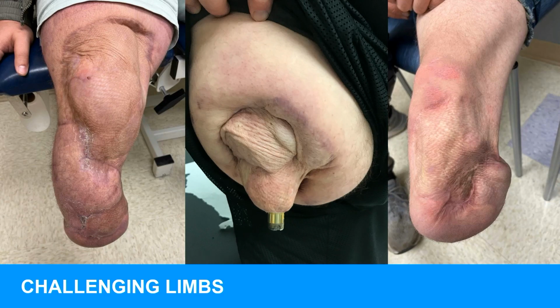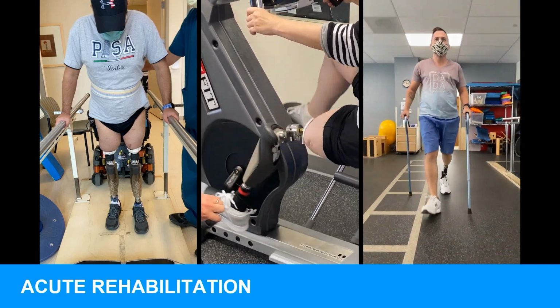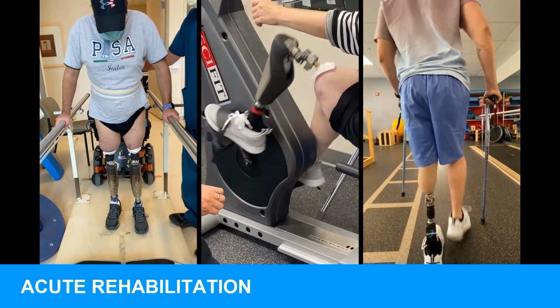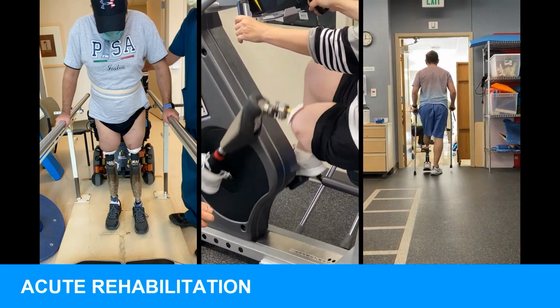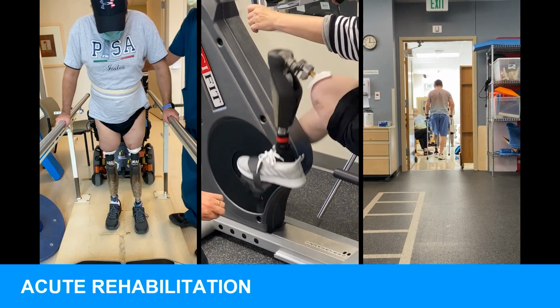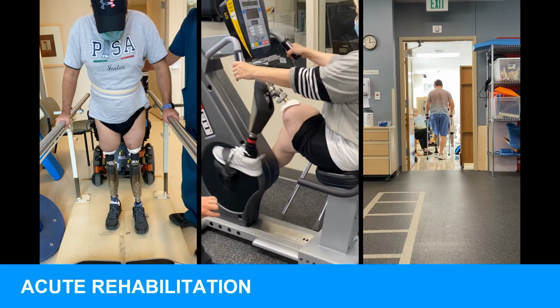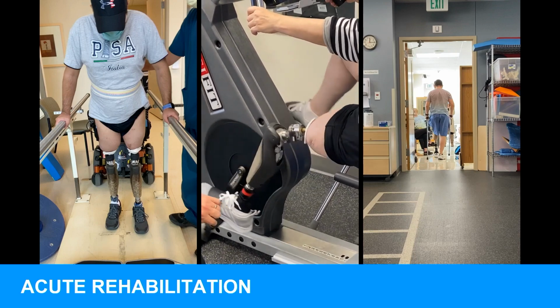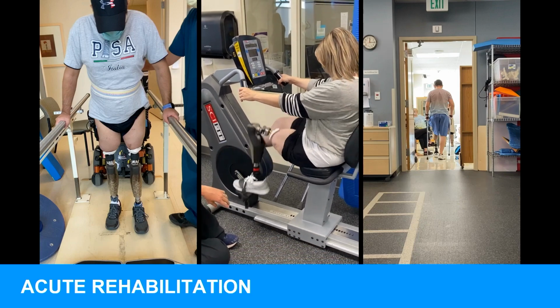As Dr. Stoneback said, he does a stage 1 surgery on day 1. 6 weeks later, with press fit, he does a second stage to create the stoma, and 2 days later, I'm putting on the abutment componentry and the rehab process begins. The patient stays with us for 3 weeks intensely. They have physical therapy 4 days a week, and I see them 2 to 3 days a week for the 3 weeks.